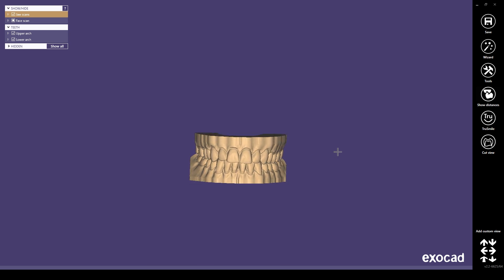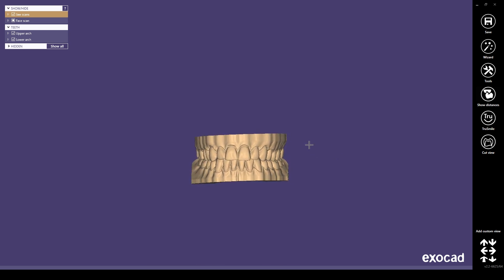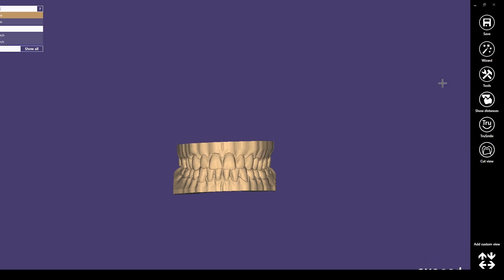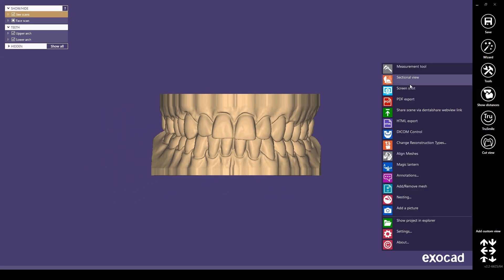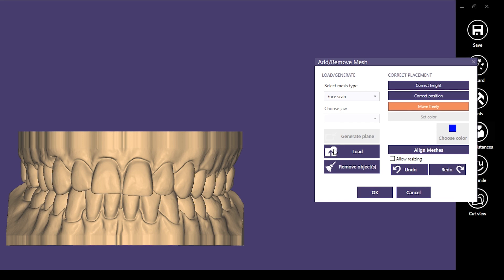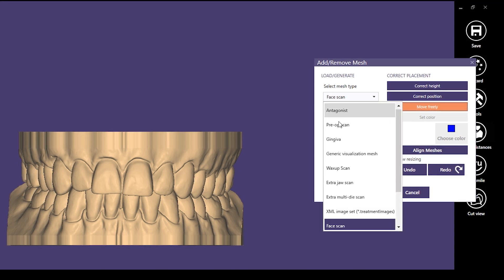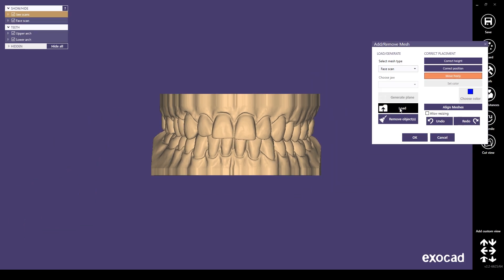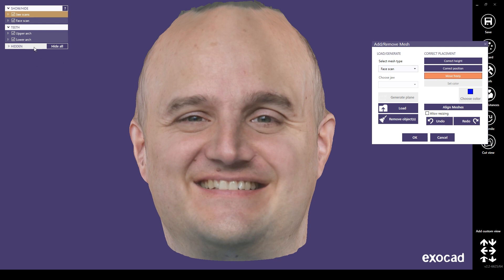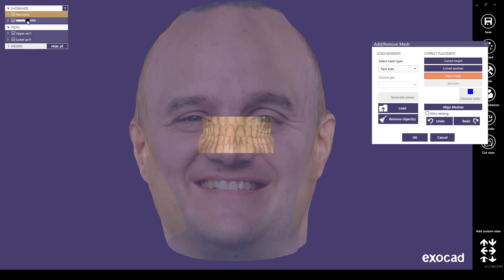Here we are now in Exocad dental software. We have the upper jaw and the lower jaw — this is the upper arch and this is the lower one. First, go into the wizard and select Expert Mode. While you are in Expert Mode, you will have the Add/Remove Mesh option in your tools. Click on that and select Face Scan — make sure to select Face Scan — and just load your OBJ file from your computer. This brings your 3D face scan into Exocad.